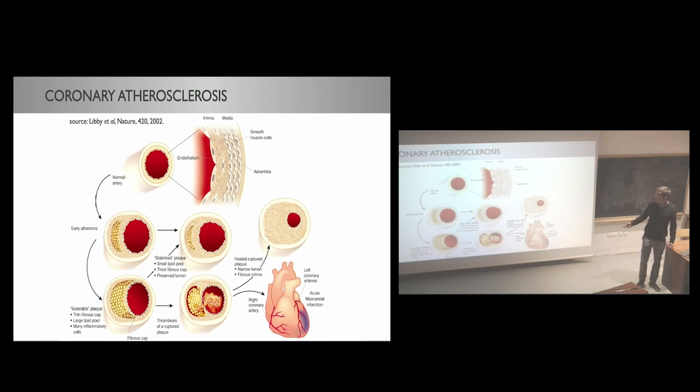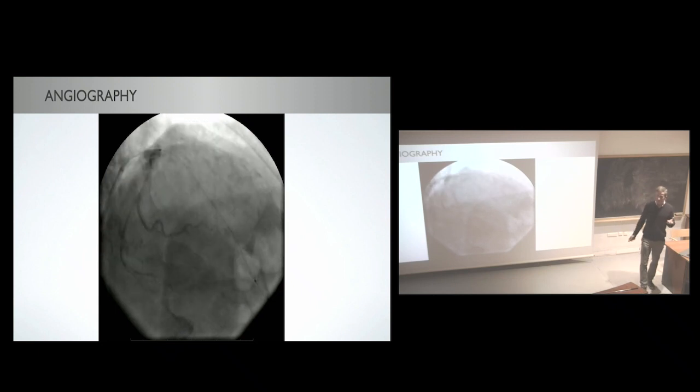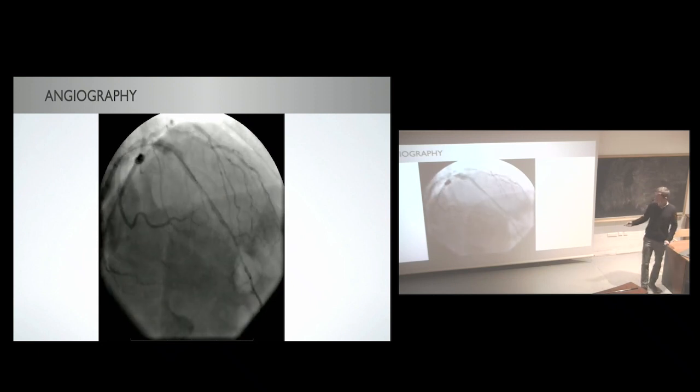In other cases, these lesions heal up and become more scarred, really collagen-rich tissue, where they simply block the blood flow, but you're no longer at risk of dying from an acute event where it ruptures. The main tool in the cath lab to guide these procedures is angiography.